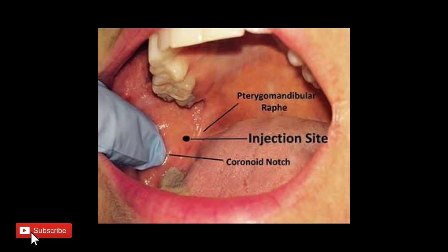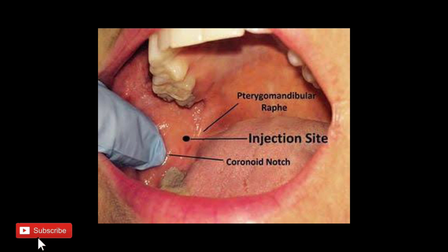The landmarks to keep in mind before giving the IANB are: the coronoid notch, which is the greatest concavity on the anterior border of the ramus; the pterygomandibular raphe, which is the vertical portion; and the occlusal plane of the mandibular posterior teeth.